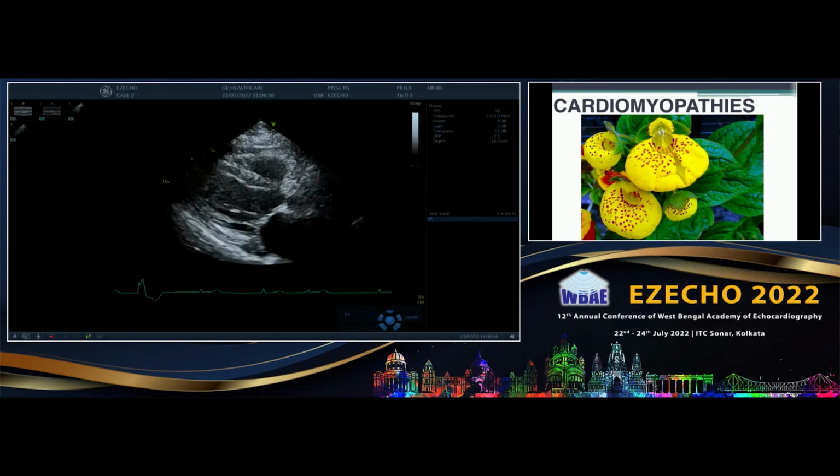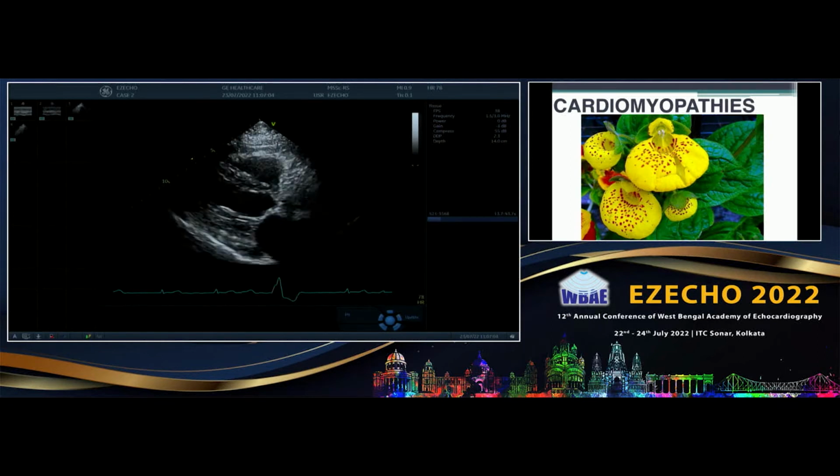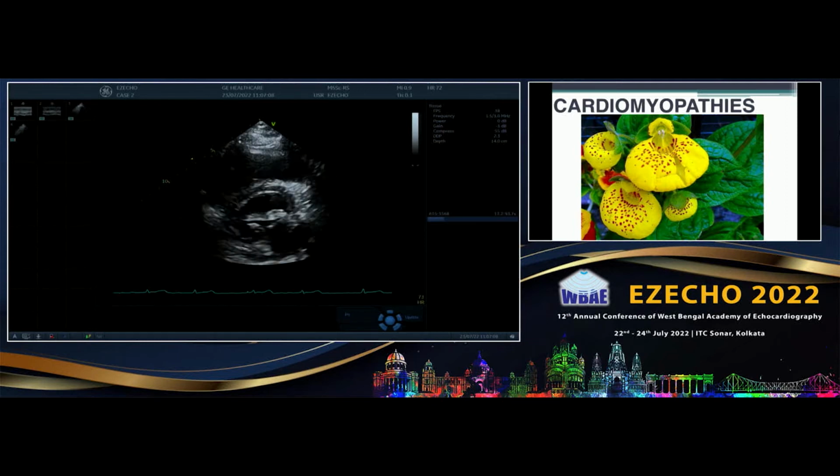Now, why don't you go posteriorly? Because generally there is a dependent edema. So you do it anteriorly: between the anterior axillary line and mid axillary line, and between the anterior axillary line and the mid-clavicular line, because they are anterior ones. There, if you get edema, that means definitely the wedge pressures are quite high.